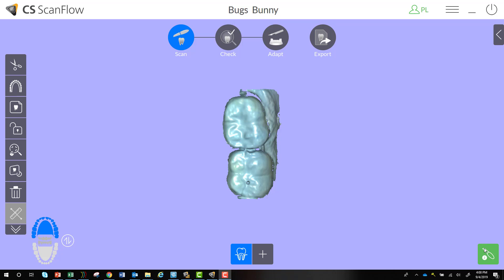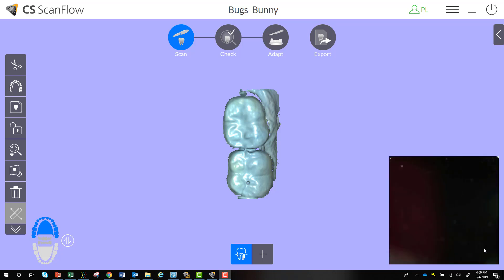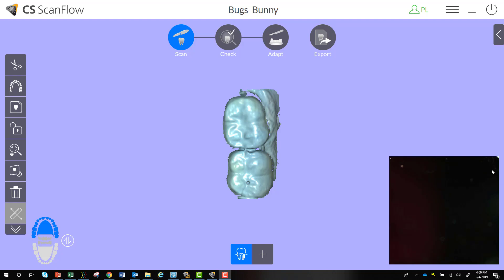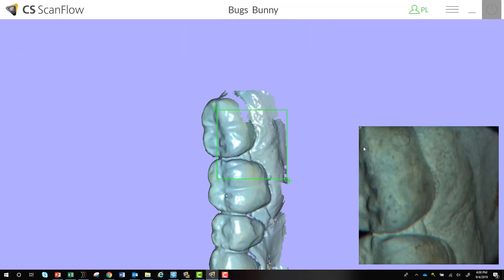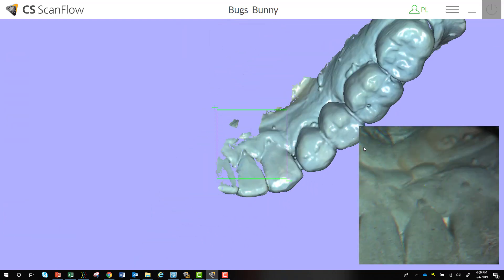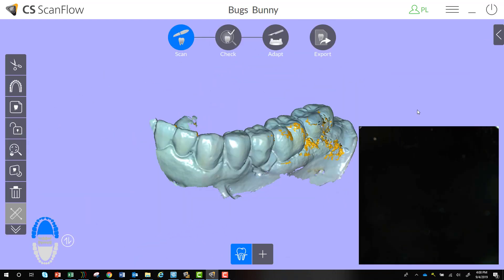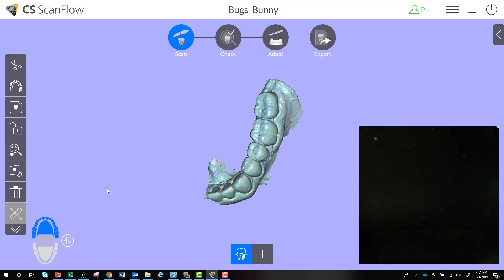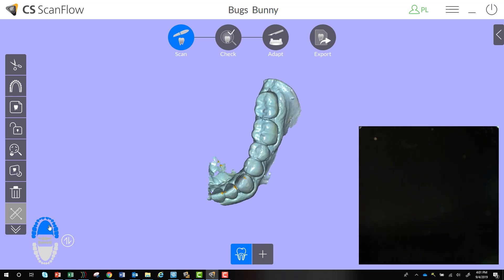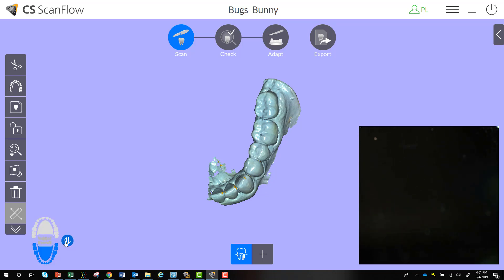I'll go ahead and finish scanning a quadrant of my initial common scan. You can see I scanned the lower arch but have the upper arch selected. This is now your switch button, so I can switch to the appropriate arch.